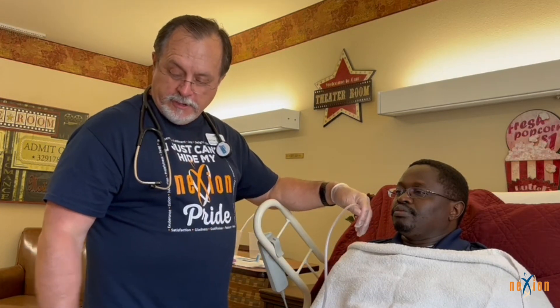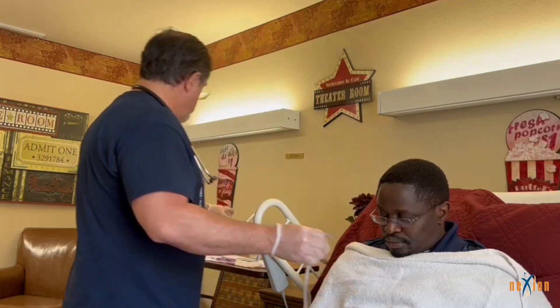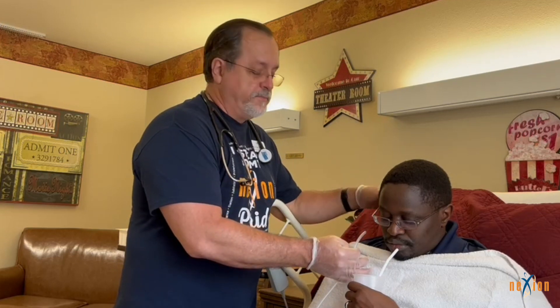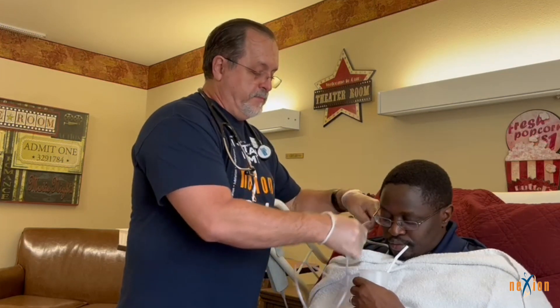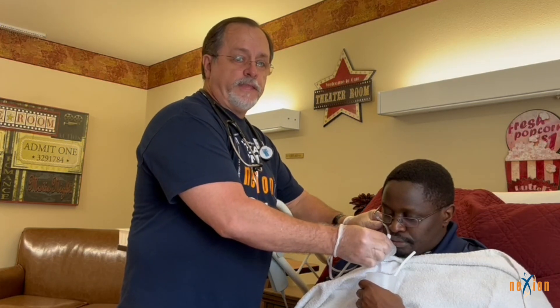After the tube is in the nasopharynx, flex the resident's head toward their chest. Take a moment, let the resident breathe and relax, and have them take a deep breath. If they are able to drink, give them a cup of water. When they take a drink of water, insert the tube forward another three to five inches, then stop. Have them take another drink of water and insert the tube further. Repeat this until you reach the tape marking on the tube — that is how far you want to go.